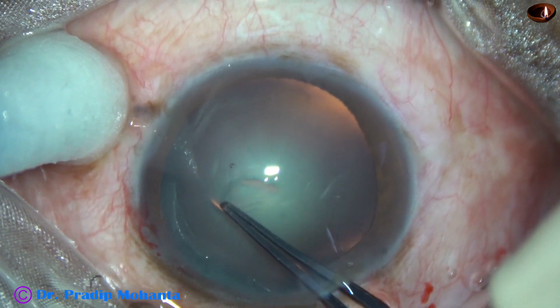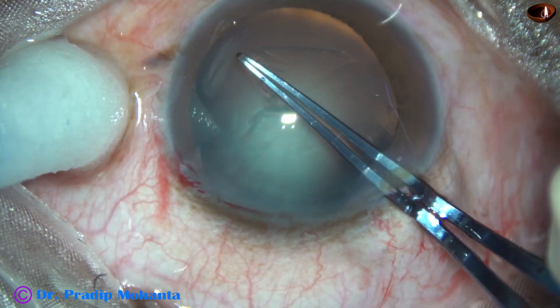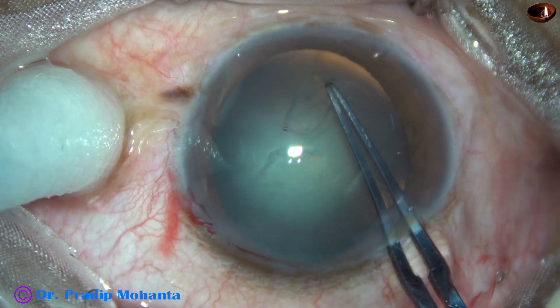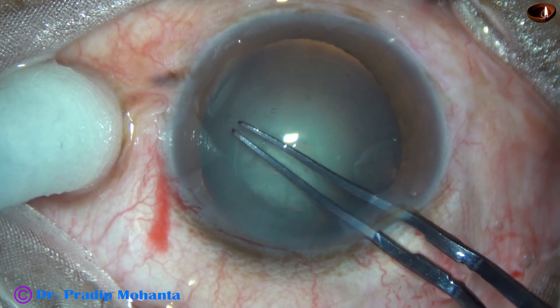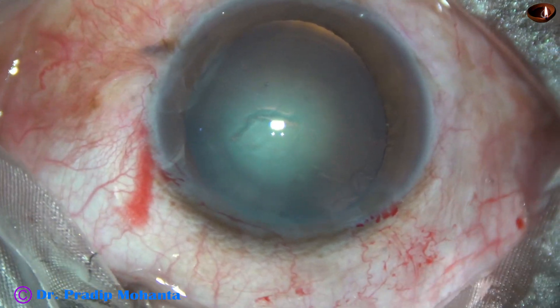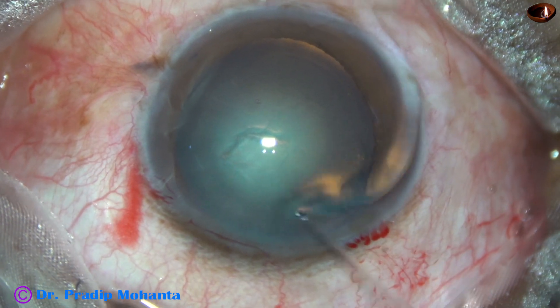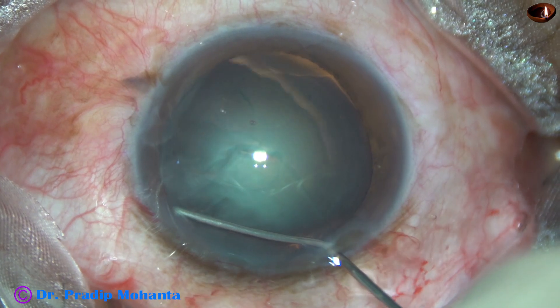This is capsulorhexis with Utrata forceps. The central part of the capsule is pricked. A capsular tag is raised and this capsular tag is guided all around to get an adequate size rhexis.